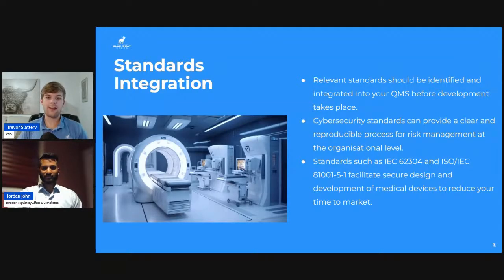Now, cybersecurity standards can provide a very reproducible and clear process for risk management, which is very important. One thing that oftentimes can fall a little bit short when handling security or handling risk management in general is having a little bit of an ad hoc process. If we have a clear standardized procedure, that ensures that every time we're going through the assessment of a vulnerability, mitigating a risk, it's going to be done in the same way. And that means that we'll have very clear results as opposed to something that may vary based on the assessor or based on the process.